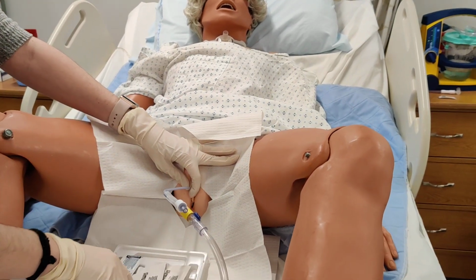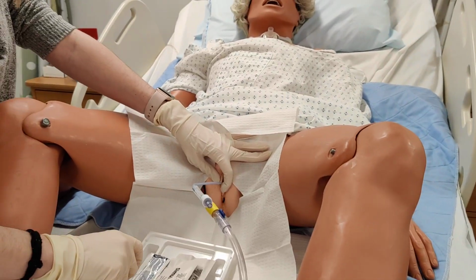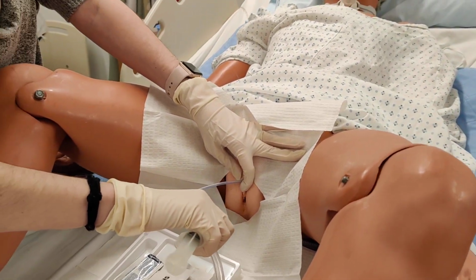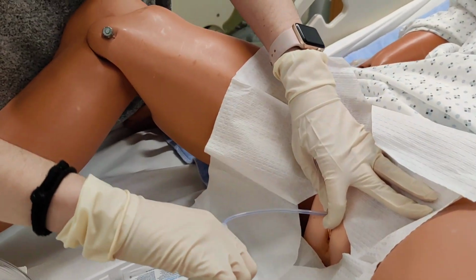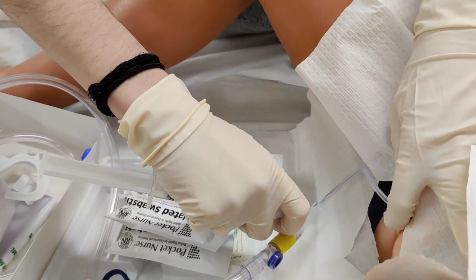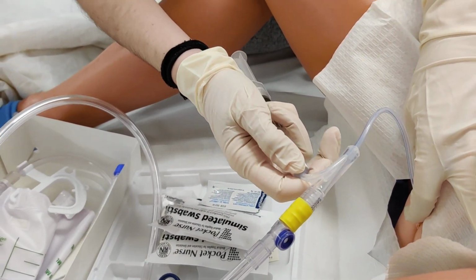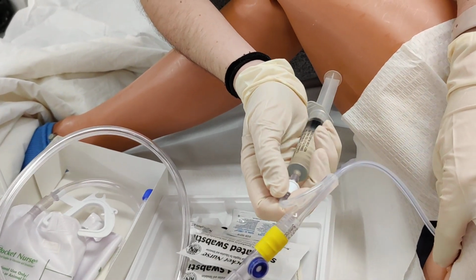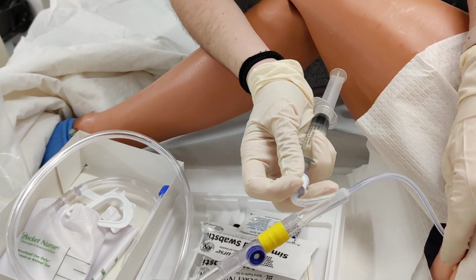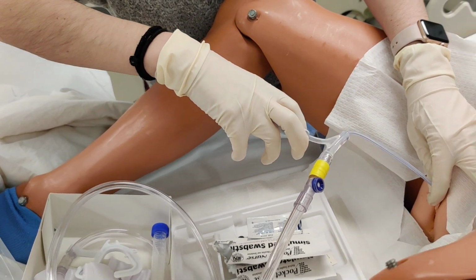Right, so on a person you'd see, like Gabby said, that flash of urine and then advance a little bit further. She's going to attach the syringe to the catheter port, to the balloon port. Now, Gabby's able to do this one-handed. However, for your practicing purposes, it would help to attach that ahead of time. That way you won't have to fumble with it too much.